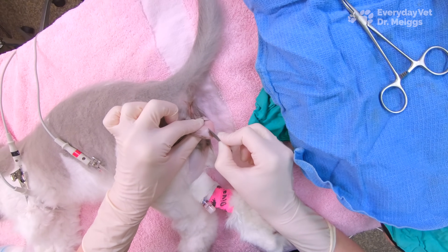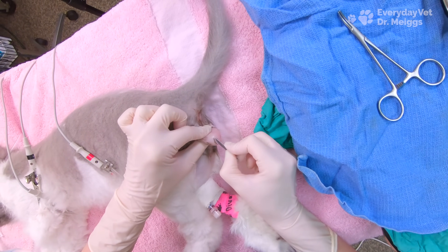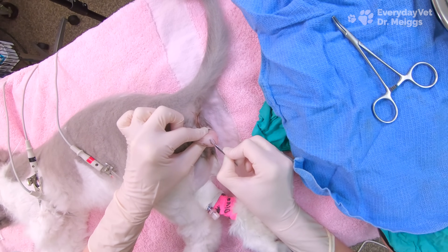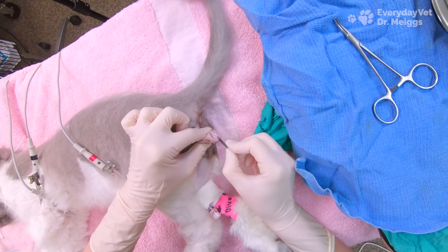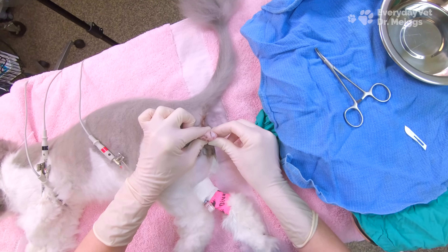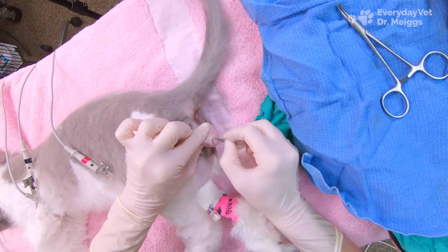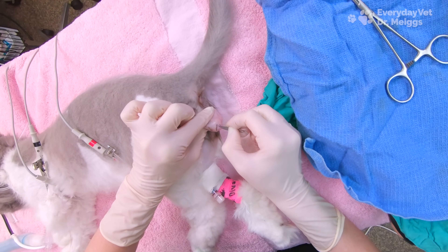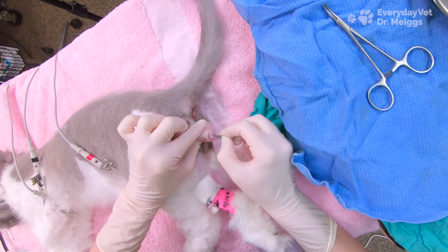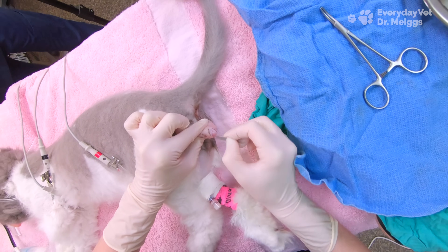I make a scrotal incision to do a cat neuter because of their different anatomy. In the dog there's a fairly decent amount of space between the scrotum and the penis, but that's not the case for the cat. The penis actually sits directly below the scrotum, and if I were to try to make my incision outside of the scrotum I could accidentally cut into the urethra, which would cause significant damage to the urinary tract. So instead we do a scrotal approach for the cat.